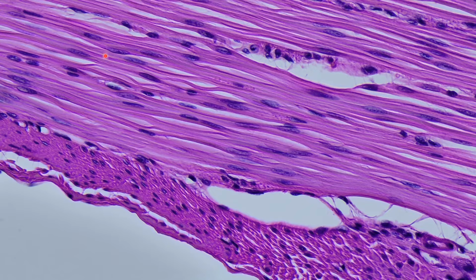So now we have cells with fibers that are orientated roughly left to right up here. But for this one, you really need to try and identify overall the shape of the cells. And to do so, we're just going to draw a few of these out. You're not going to see the beginnings and ends just perfectly for these, but overall you can see that there's a nucleus, and on both ends the cell tapers down, so we have this spindle-like shape to our cells.